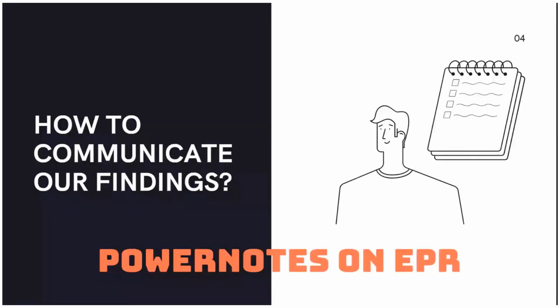So how to communicate our findings? There are power notes on the EPR. If you go to pre-configured power notes and type in POCUS, P-O-C-U-S, you will get power notes on AAA and echo and life support, and that's where you're going to enter your findings on EPR.